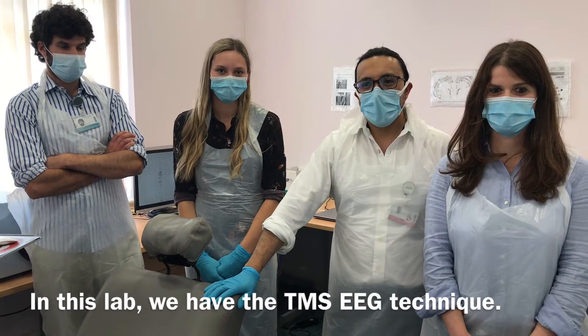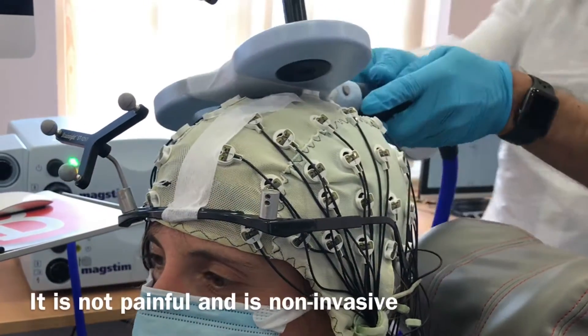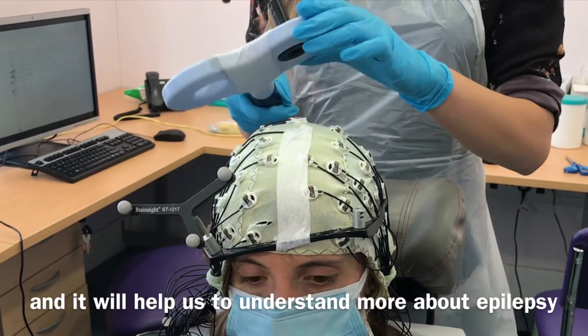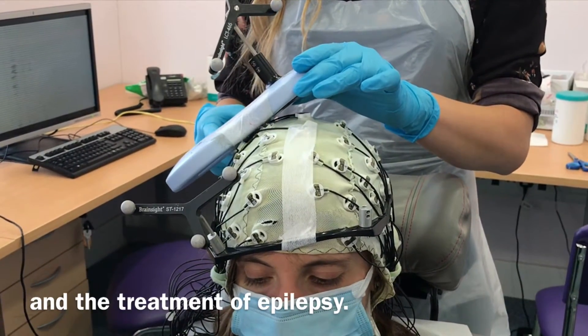Here in this lab we have this TMS-EEG technique. It is non-painful, it is non-invasive, and this will help to understand more about epilepsy and the treatment of epilepsy.